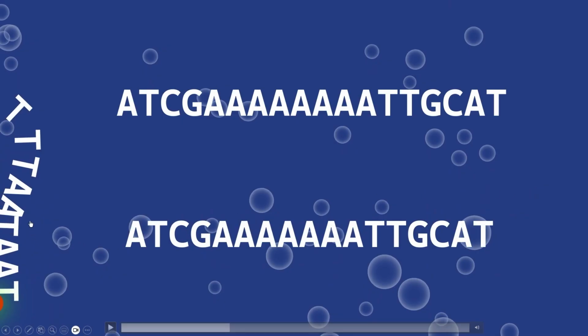And so here's where we get into the actual assay. So that was all in the actual patient cells, the tumor. So we had this deletion, and now we want to detect it. So in this assay, they discovered or looked for a bunch of microsatellites that were monomorphic. So basically, they're the same among people, and ones that are prone to this 1 base pair deletion. So they just want to kind of keep it simple, not have to worry about tumor normal, and have a very kind of clear way to detect it.